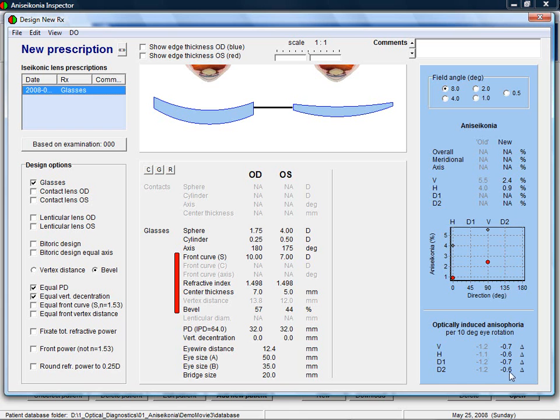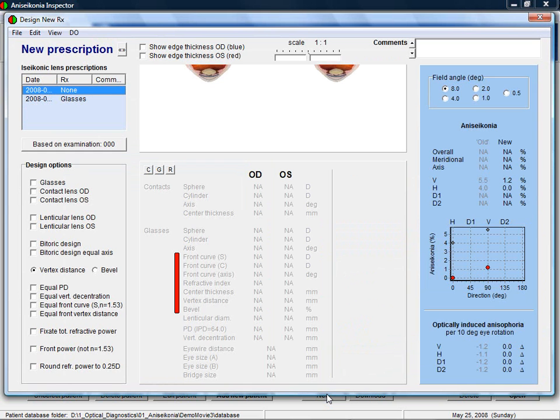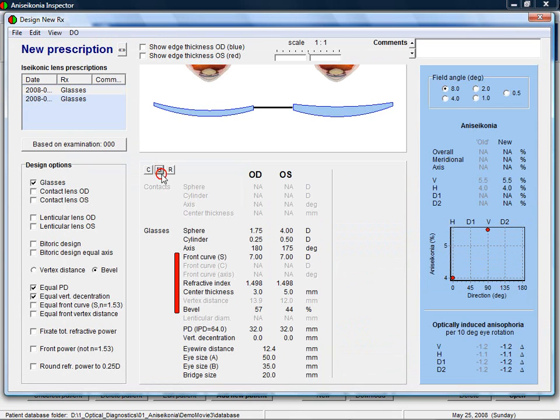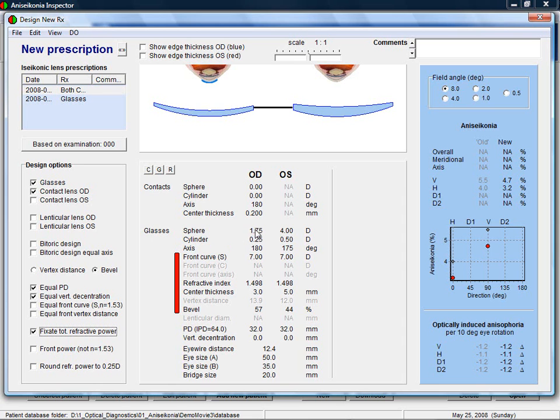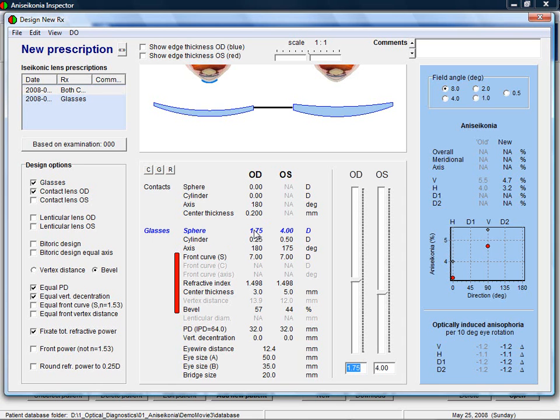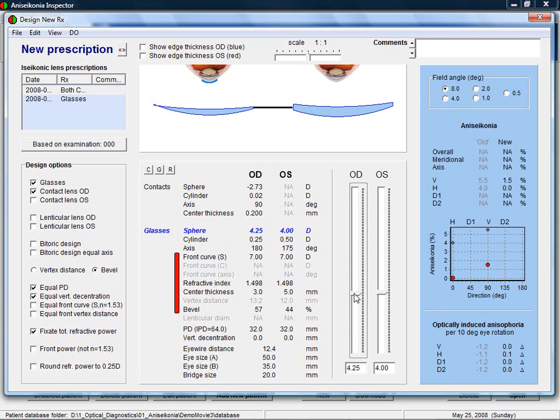Let's go back and decide a new prescription based on one contact lens. We will start again with the same glasses as used during the testing. Now we add a contact lens to the right eye. A very useful option is to keep the total refractive power constant. If now the power of the spectacle lens is changed, you can see that automatically the power of the contact lens is updated to keep the total refractive power constant.